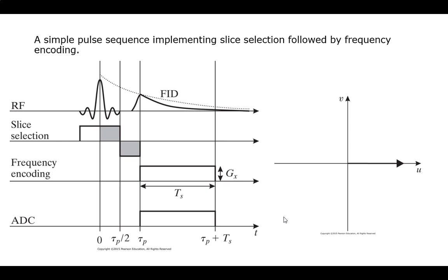So that one's now resonating, and then after a little bit I'm going to be able to measure, right? I can't measure right away, because I have to cancel all my little phase corrections and everything. I don't want this to go on forever, so I have to kill that off. That will allow this signal to become apparent and visible to me.